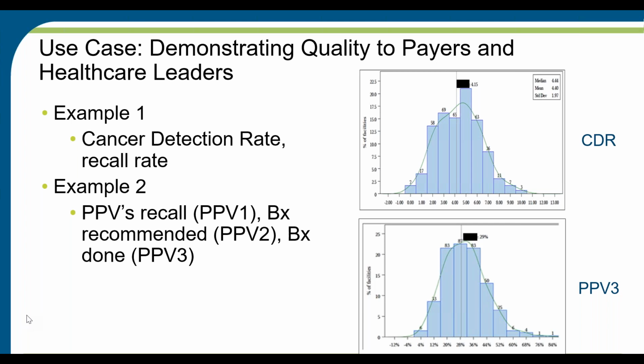Yeah, and one other point that needs to be made for these is anything related to cancer depends on the statistics of how many cancers you find, and Gretchen's well aware of that. So if the estimated number of cancers is fairly small, you're going to have a wide range of just random variability. That's one of the major advantages of having higher reading numbers; your statistics for cancer will be much better.